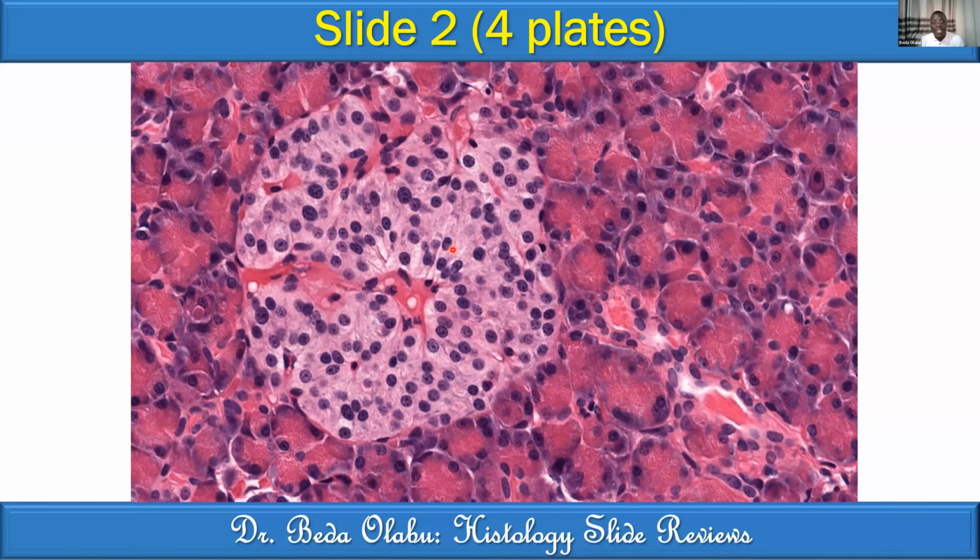Then this is the cluster of hormone-producing cells. That is what we call the islets of Langerhans. Remember the cell types of the islets: alpha cells, beta cells, delta cells, PP cells. And remember their secretions as well. Remember the functions of the hormones there. So we agreed that is a theory component. We are not addressing that in this particular session.